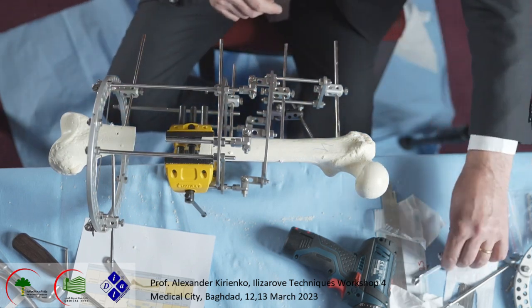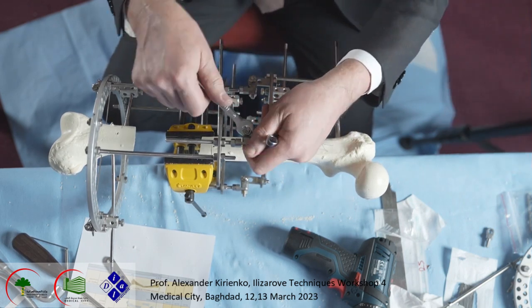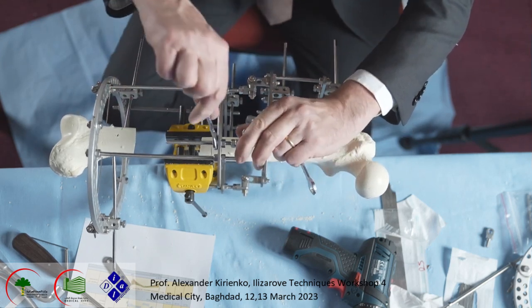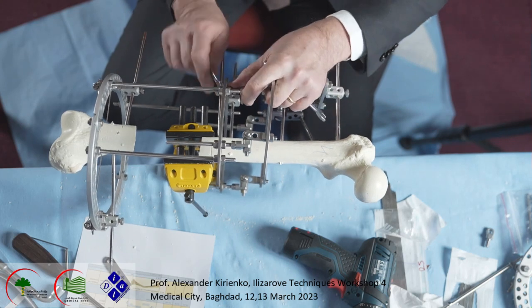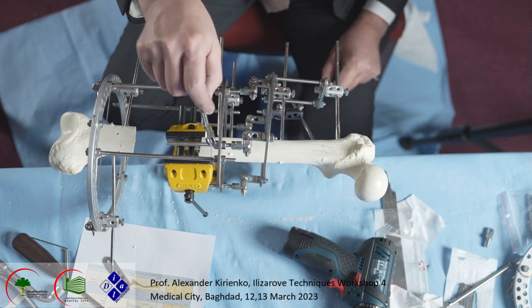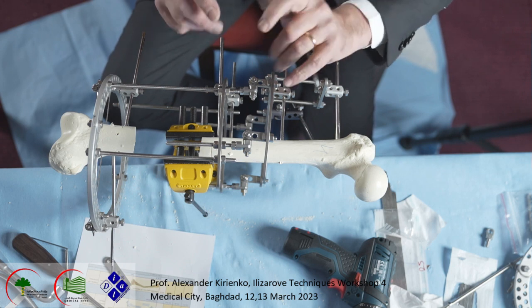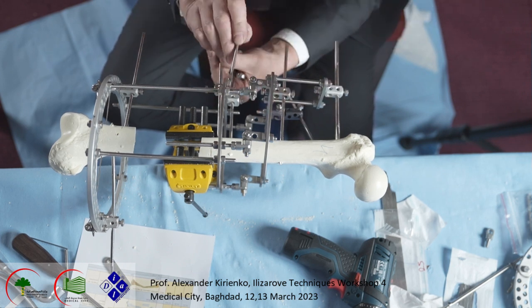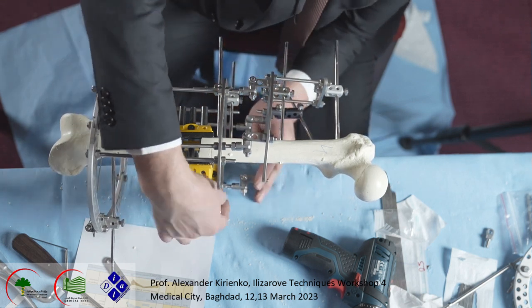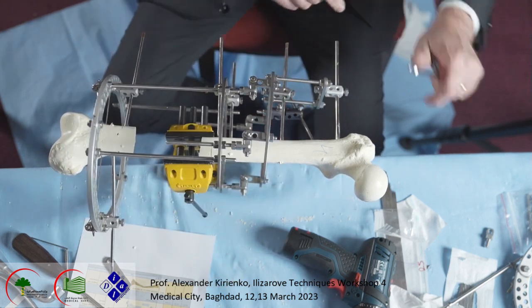We need to do osteotomy. Like I said before, we should disconnect them. Now maybe we don't do it because it's the same procedure, but you need only to release a little bit the nut. Like I said, we mark the length of this rod with a marker, so that when we finish the osteotomy, we put everything in the original position. This is important, because after osteotomy it is really dangerous to have displacement. The less displacement, the better.